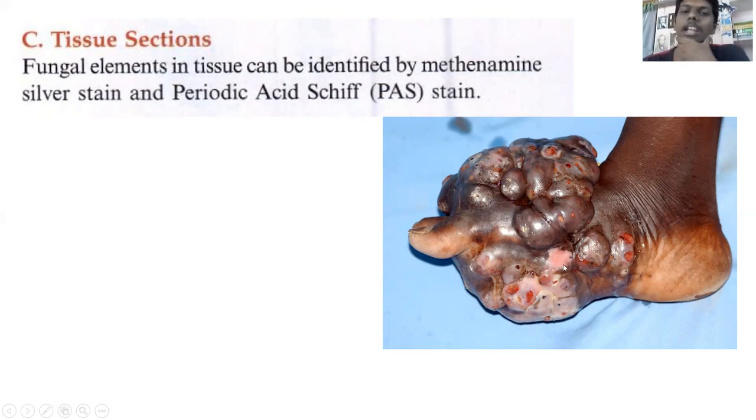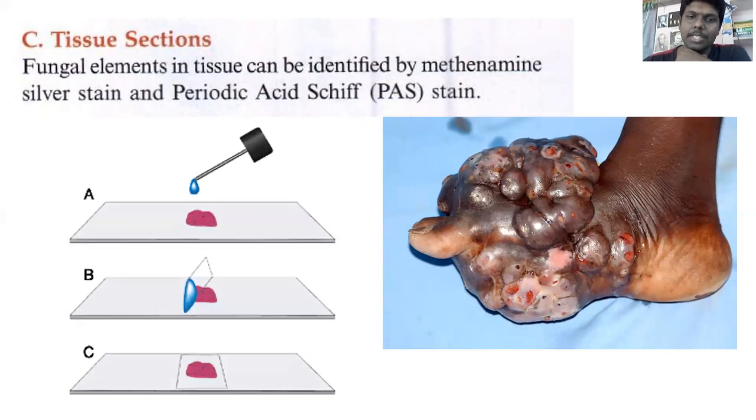So how can we determine this is a fungal infection? We will take a biopsy of the skin, and we will go for PAS staining on the slide. Then we will be able to diagnose, yes, this is mycetoma infection. So that is all about your laboratory diagnosis of fungi.